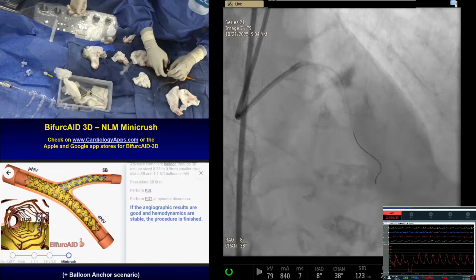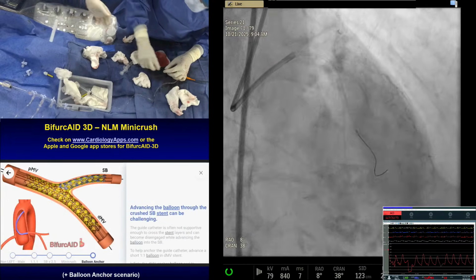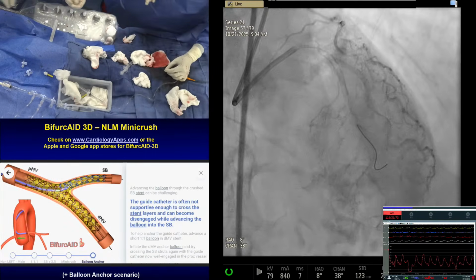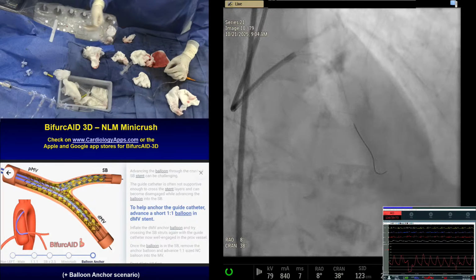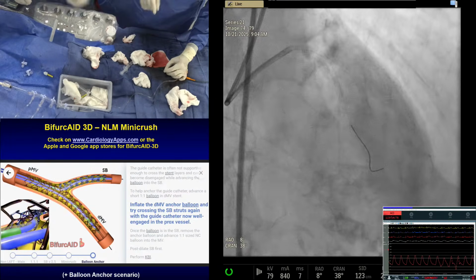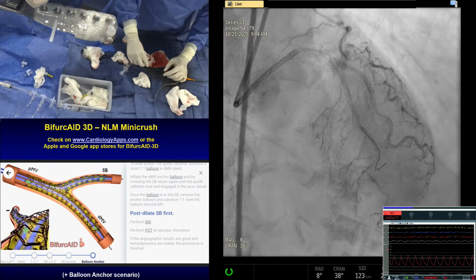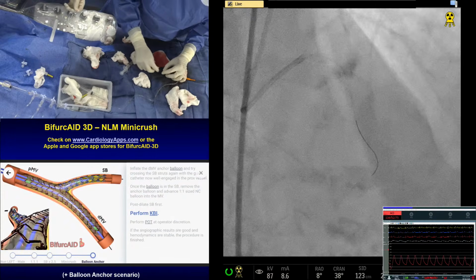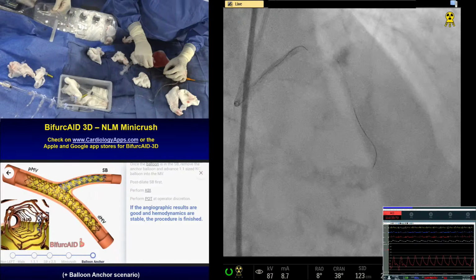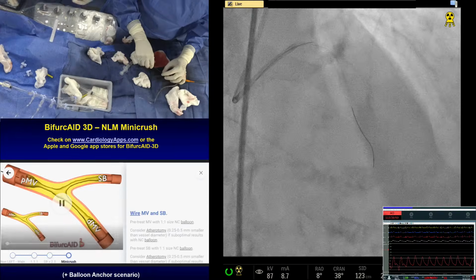Diagonals are notorious for perforation. Get the compliant balloon which we had before. Diagonals are notorious for perforation, especially when you're using cutting balloon with high pressure. If you have noticed, when I told the fellow go 18-20 atmospheres at the ostium, but as we went to the body of the diagonal, we went about 12 atmospheres.